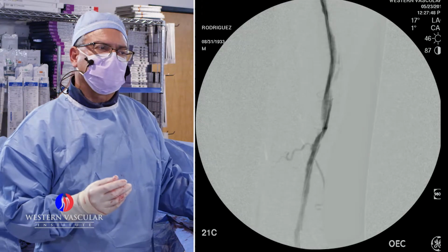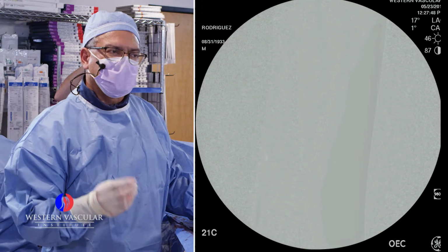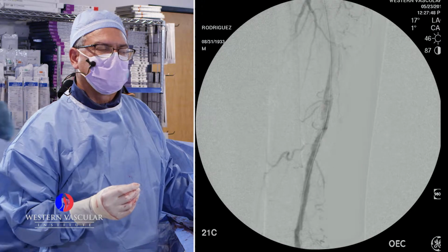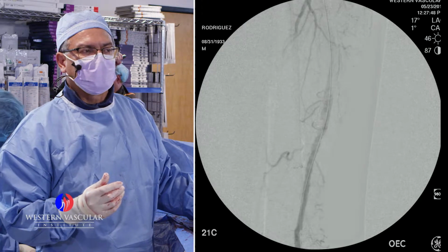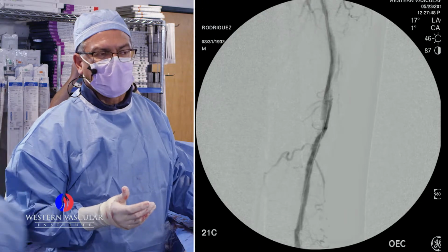You see there's still a lot of plaque causing constriction in some areas, like the one in the middle right there is very tight still. It looks very irregular along the length of the artery itself, so I know that angioplasty alone won't last as a therapy.